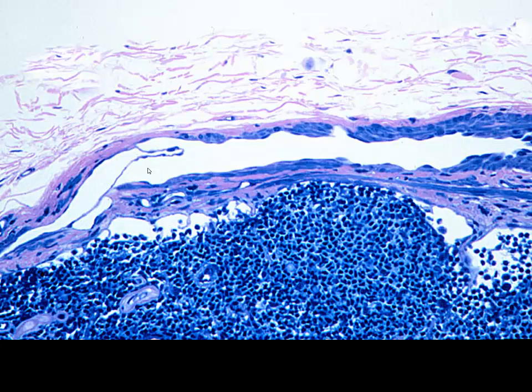Now, in this particular image, there probably is enough information here for you to determine what this organ is. And as we do, we're going to see our connective tissue capsule. We have certainly our lymphocytes here. We've got our subcapsular space. We can see a trabeculae diving down. And then out in this capsule, we can see a vessel. And we see the leaflets of this vessel. No red blood cells, practically only endothelial cell thick, a lot of connective tissue surrounding it. So this is going to be an afferent lymphatic vessel present out in the capsule of a lymph node.